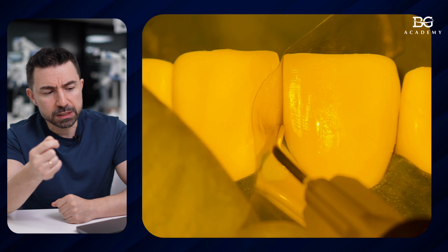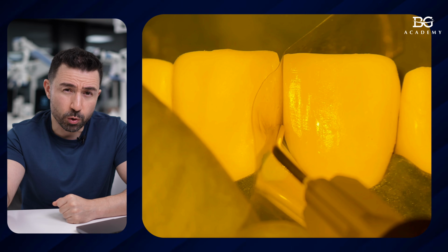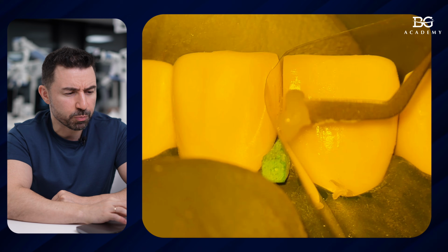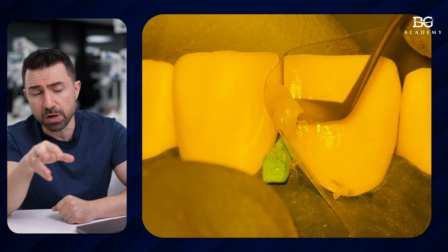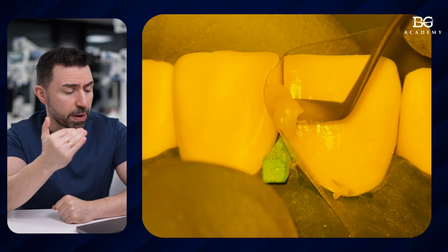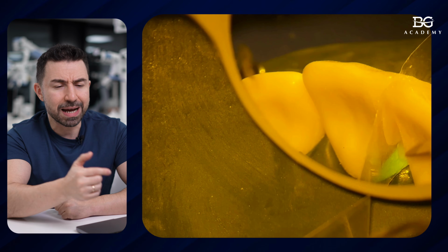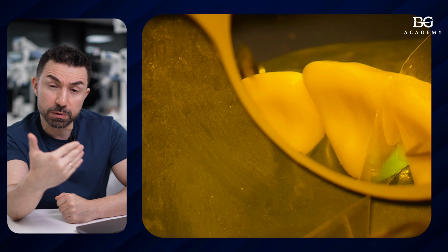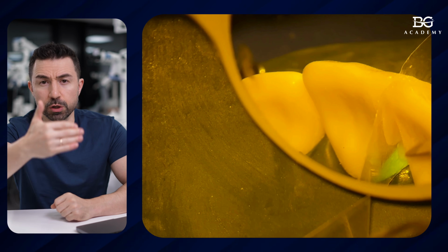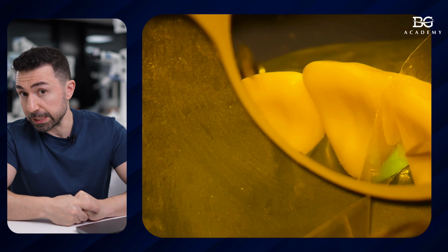And then step one is to use highly filled flow restorative composite, for example General Universal Flow injectable, okay? So we just put it to the matrix, spread it with a thin instrument, and before polymerizing I take a packable composite straight away and I start to pack packable composite using a thin instrument to the interproximal area until I'm able to see exposed composite from the palatal surface, okay? This is very important because the whole interproximal area has to be filled with composite resin, okay?